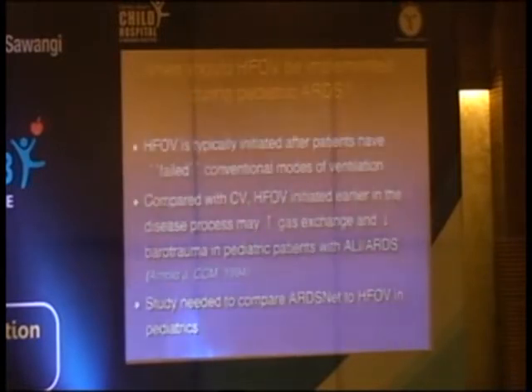That's up to you. So in these patients, high frequency is usually initiated as a rescue form of therapy when they fail conventional. Compared with conventional ventilation, high frequency initiated earlier in the disease process may improve gas exchange and reduce barotrauma in pediatric patients with ALI, ARDS. And that's based on a very old study. It was one of the only studies that randomized patients to conventional ventilation, who knows what they were doing for a conventional ventilation strategy, to high-frequency oscillatory ventilation. That's all we really have to go on.